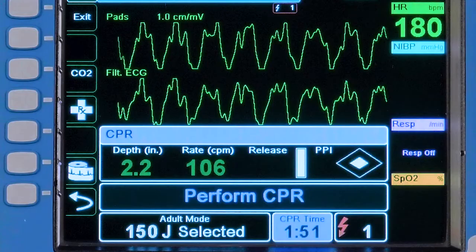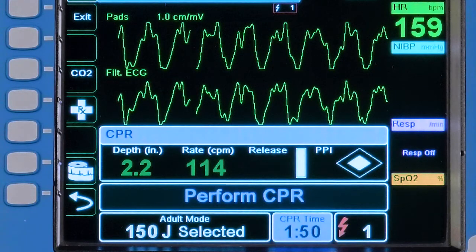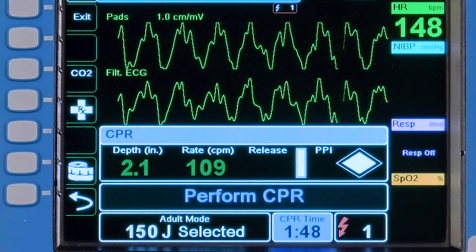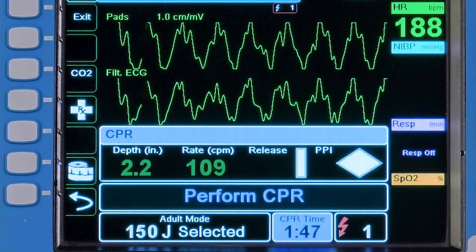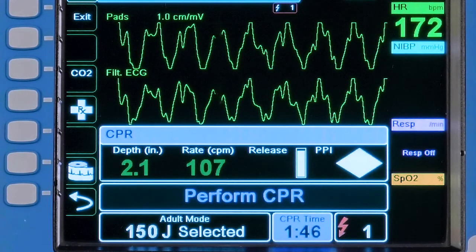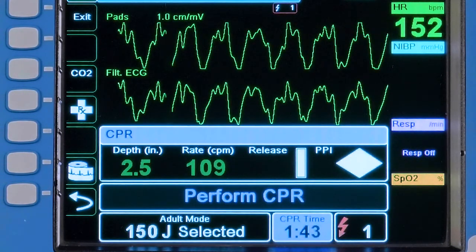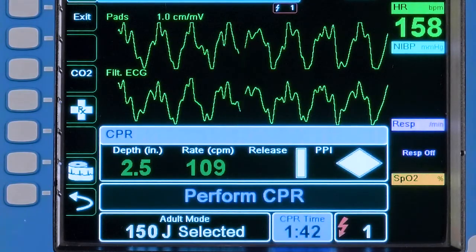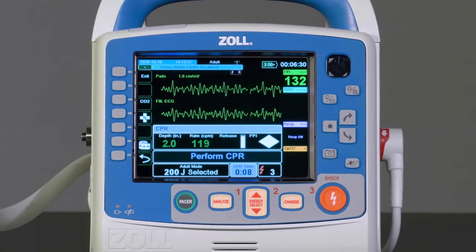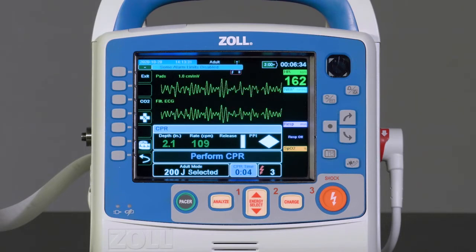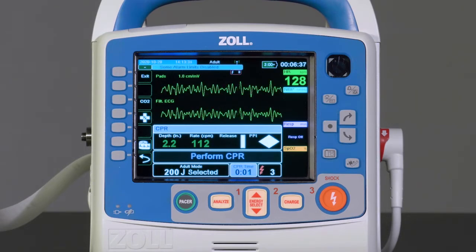The X-Series Advanced will continue to prompt two-minute cycles of CPR followed by analysis and a shock or no shock message. If enabled in the device, the rapid shock algorithm will be used to help further decrease pre-shock pause in AED or rescue protocol mode.